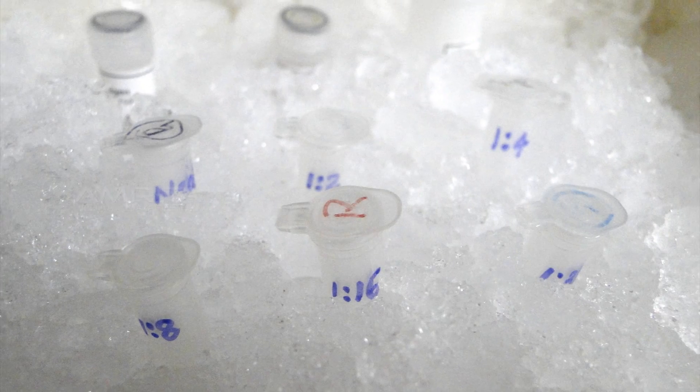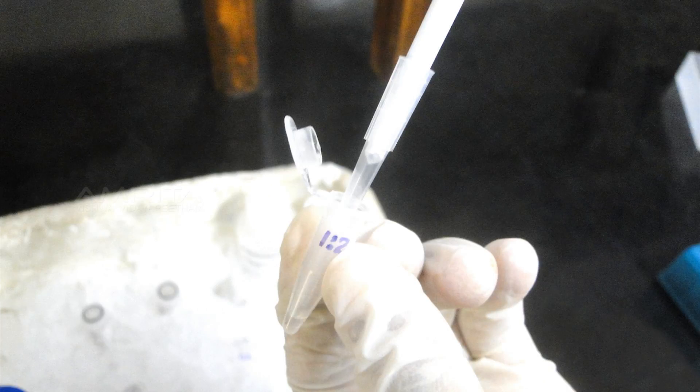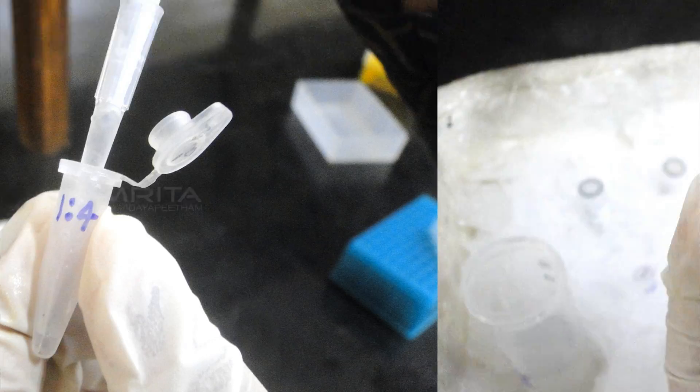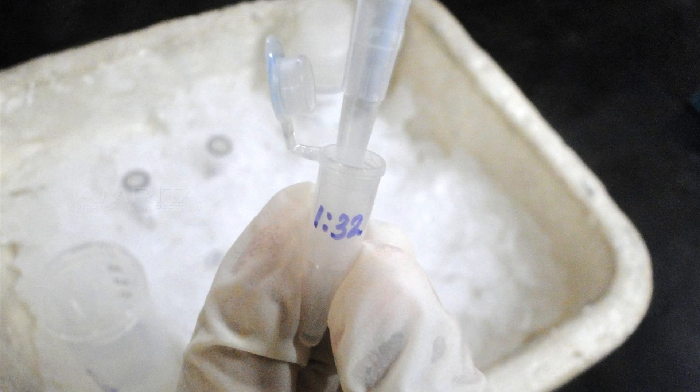Take 6 vials and label them as NEAT, 1:2, 1:4, 1:8, 1:16, and 1:32.